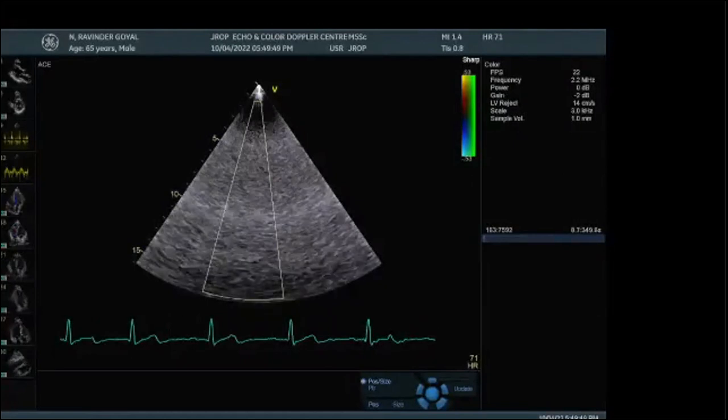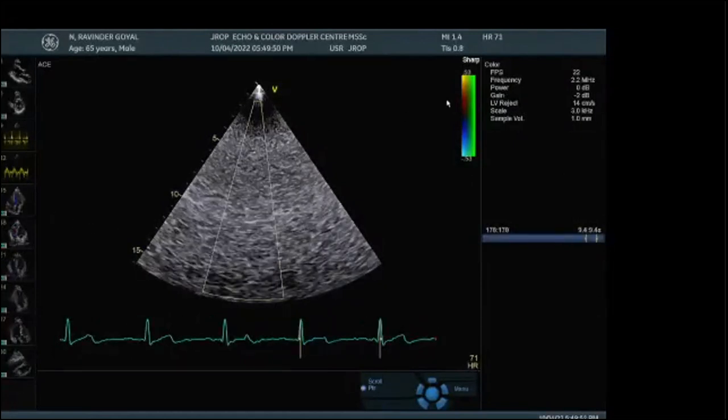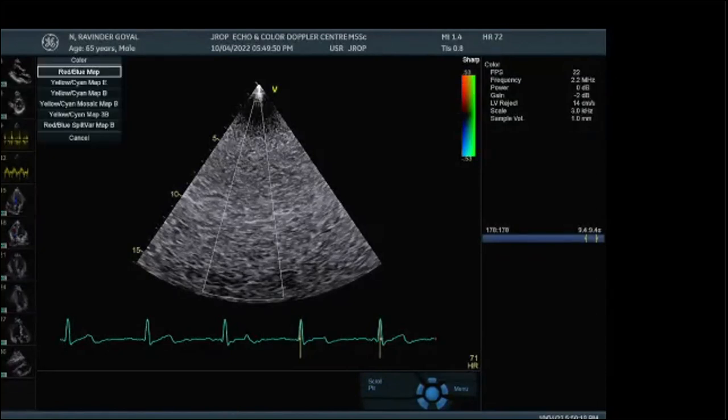In my screen, what you are able to see is red, yellow, blue, and light blue. These are the colors of the rainbow: violet, indigo, blue, green, yellow, orange, red. This is known as the variance scale. What you were talking of, you can use these colors, you can change to them, right? Yes, sir. So you can choose any one. It all depends on you. This is what colors you have been choosing over a period of time.